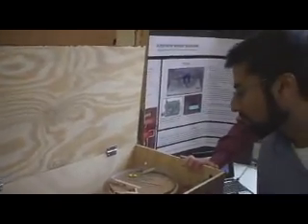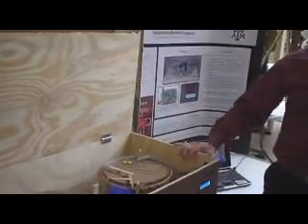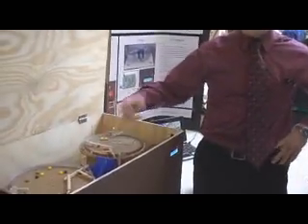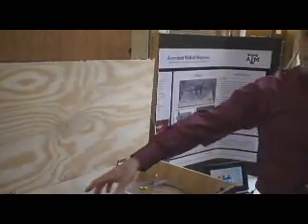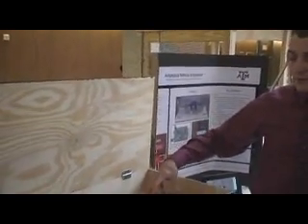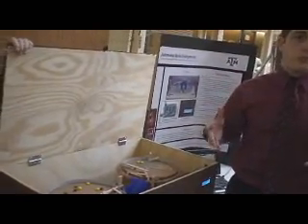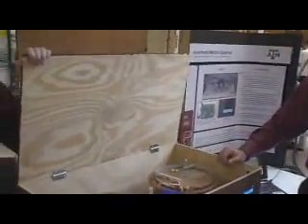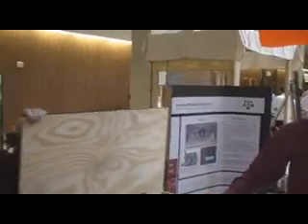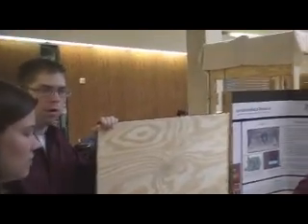So was it able to count it when 2 of the pills went at basically the same time, or would that be an error? We have IR sensors here, so basically whenever that beam is broken, it'll count as one. And if it runs at the set speed that we have, it's enough to just drop about 1 pill every 1 or 2 seconds if they get lined up. We tried to use a system that would not be shape specific, so it'd be universal for any type of pill size. A beam broken is going to be whether it's a small pill, long pill, a round pill, anything at all. It works essentially the same way.